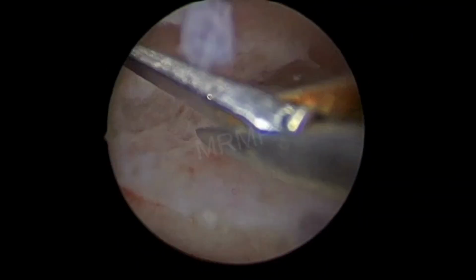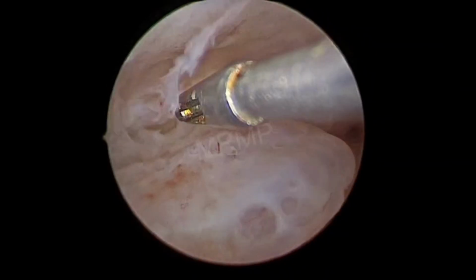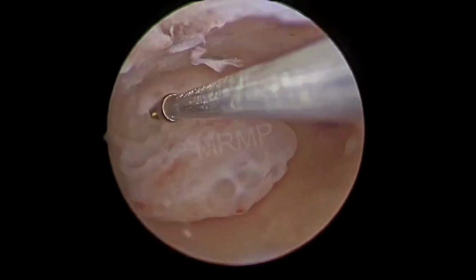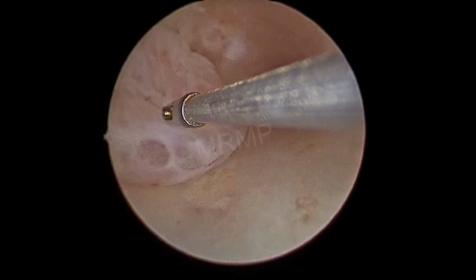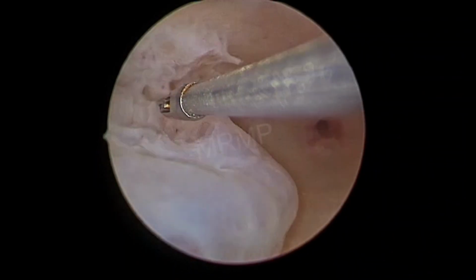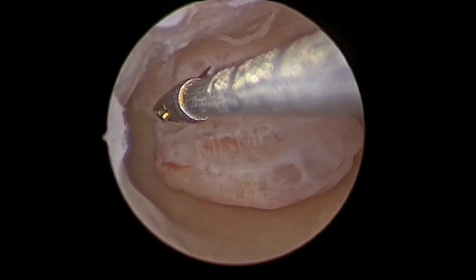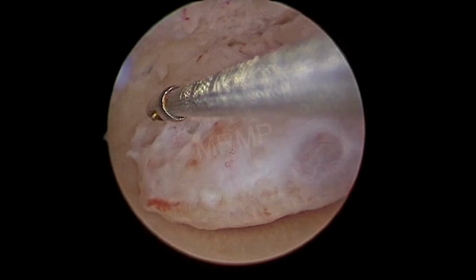With gentle and precise cuts, the stalk is severed without the use of electrosurgical energy, ensuring minimal endometrial trauma. There is minimal bleeding which settles spontaneously. If there is a small bleeder, it will settle spontaneously. The detached polyp is retrieved using ovum forceps and the specimen is removed intact for histopathology.